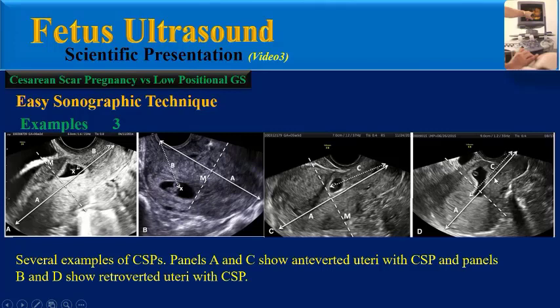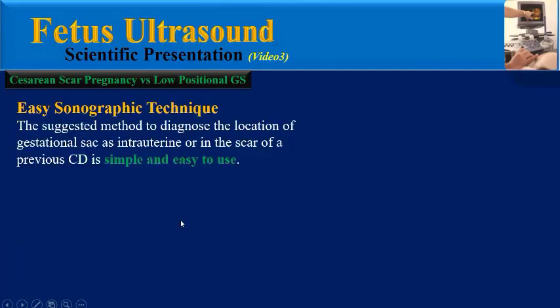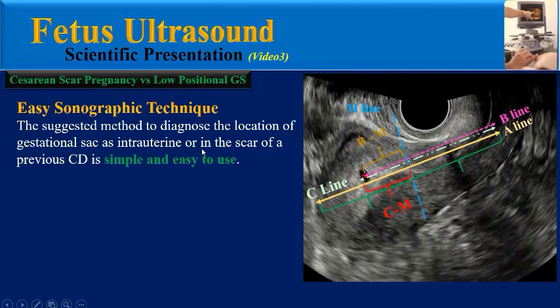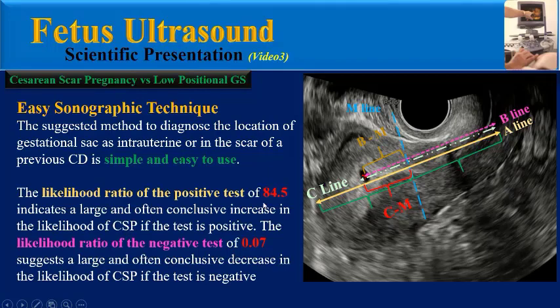These two images show a retroverted uterus with CSP. The suggested method to diagnose the location of the gestational sac as intrauterine or within the scar of a previous caesarean delivery is simple and easy to use, requiring only one longitudinal image of the uterus in transvaginal ultrasound. The likelihood ratio of a positive test of 84 indicates a large and often conclusive increase in the likelihood of CSP if the test is positive. The likelihood ratio of a negative test of 0.07 suggests a large and often conclusive decrease in the likelihood of CSP if the test is negative.